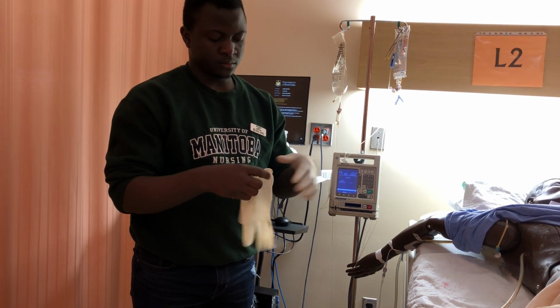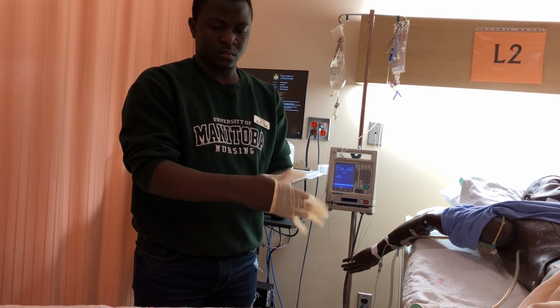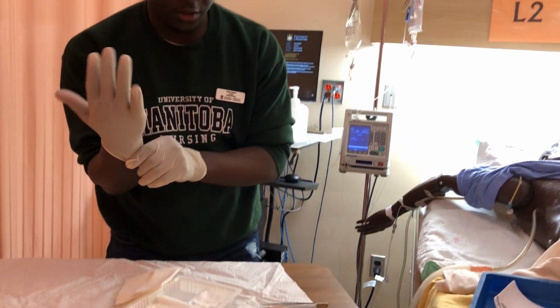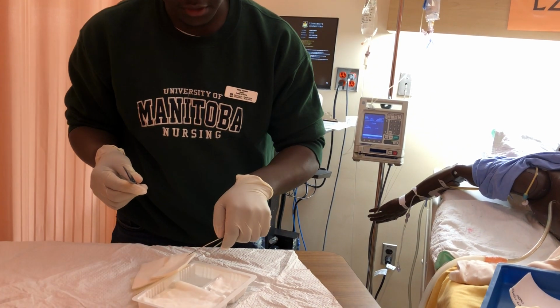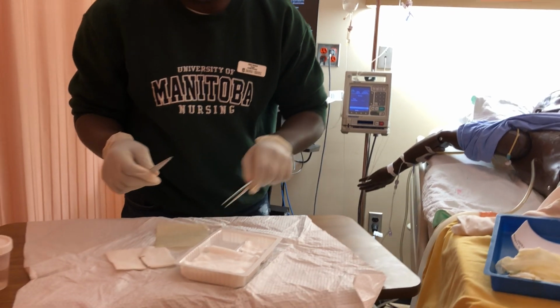Okay, and I do realize this side went off, so I'm going to have to keep all my supplies on this side after. I'm just going to throw this into the garbage and make a garbage can there. At this point, I'm going to start cleaning my wound. The patient said it's okay if I use his bedside. I can just put this on the sides, making sure to maintain my 1-inch border with this.